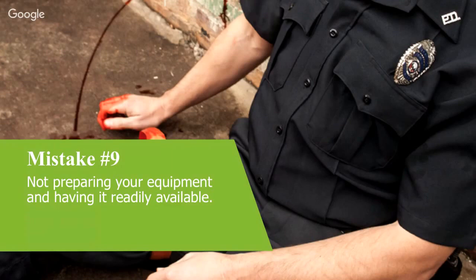So we talk about the diver's triangle sometimes. I think Will from Canada has a good post on his blog about the diver's triangle. Same thing, being able to get it with both hands. We know that it's a very, very small percentage of people that apply a tourniquet to themselves single-handed, but it does happen. So being able to reach that tourniquet with both hands is an important thing, and that's why they use that diver's triangle.